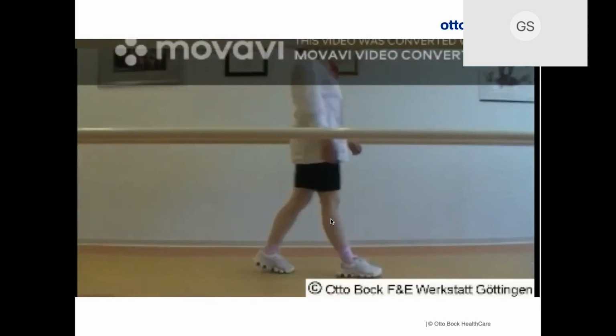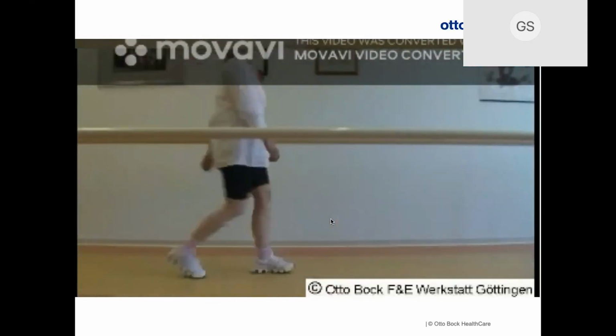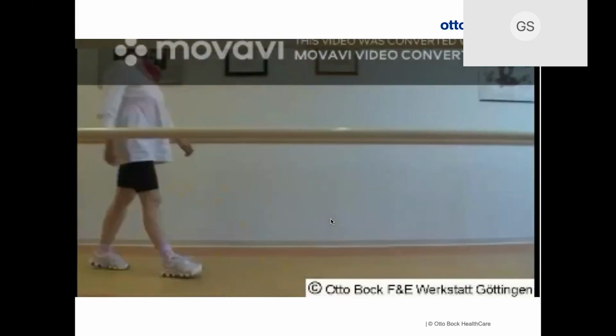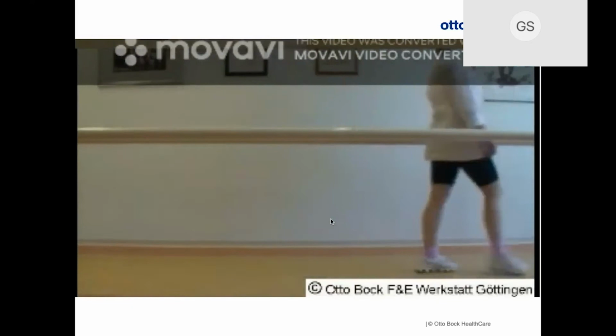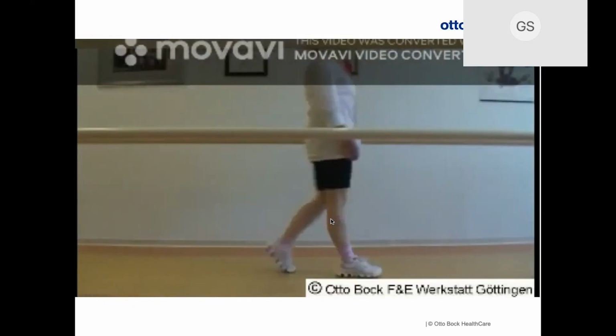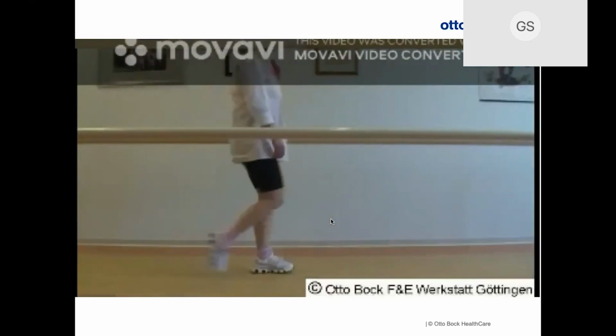So this is the type of patient you typically see. What types of gait deviations do you see? You probably see a little bit of recurvatum. We see a little bit of excessive plantar flexion, a delayed time on the limb.